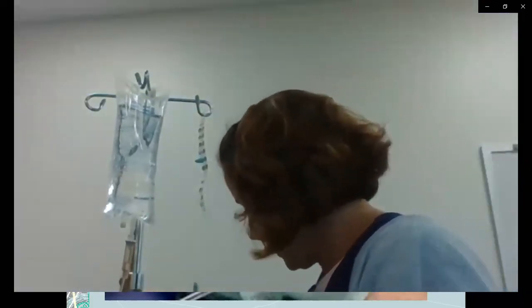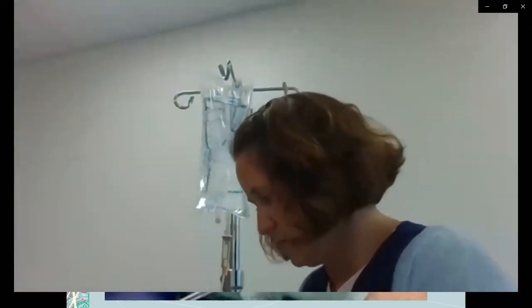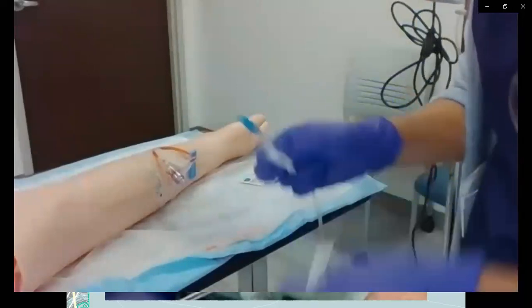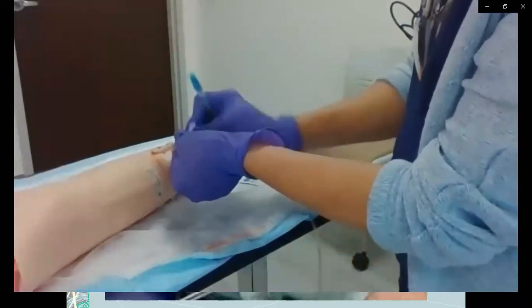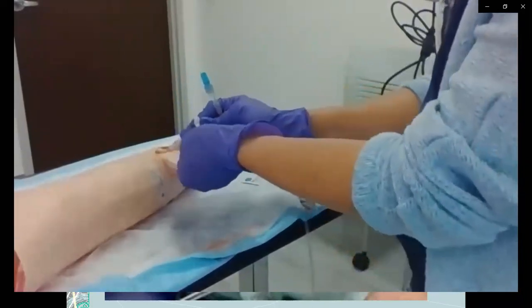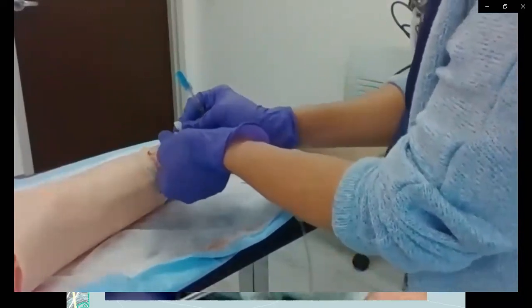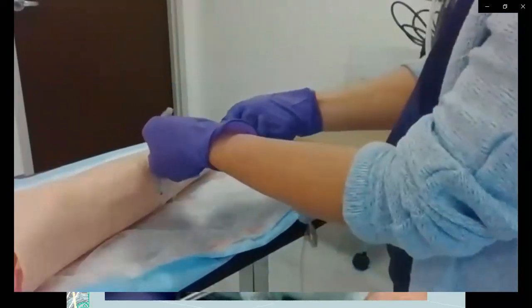Okay, so if I'm going to start this on my patient, I'm going to turn you towards my patient for real quick. As we said, if we're going to start some fluids, we want to scrub this hub. This thing has been laying there. This patient got his breakfast all over it, and it's been sitting up against his bed, getting all sorts of normal flora, bacteria growing all over it. So we're going to clean it really, really good. 15 seconds scrubbing the hub.